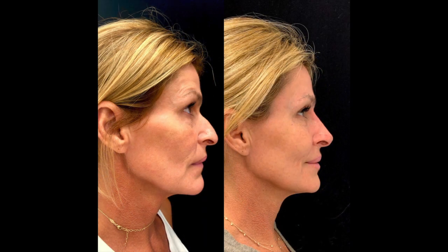Today, in my practice, I use hyaluronic acid-based fillers for several reasons, including that they are safe and durable with highly cross-linked products, a high G', and the option for dissolvability. Non-surgical rhinoplasty is a powerful and beautiful technique for optimizing the aesthetics of the nose. With precise and safe technique, non-surgical rhinoplasty is an effective and appropriate modality and alternative to surgical rhinoplasty. Avoidance of complications and strict respect of nasal anatomy are needed to ensure best results.